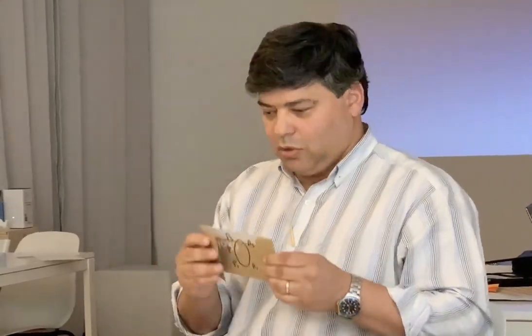Now we have already done the septum, the left side of the septum, the right side of the septum secundum. Now we are going to start to make the structure here. This will be the anterior part. Using this, the middle, exactly at the middle of the heart is the aorta. Anterior and left is the pulmonary.